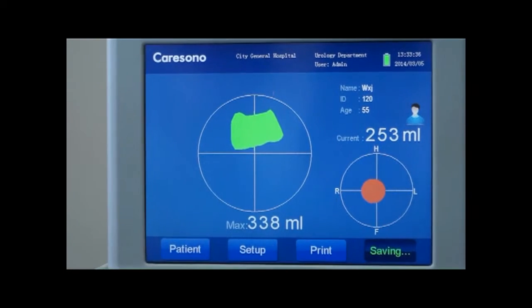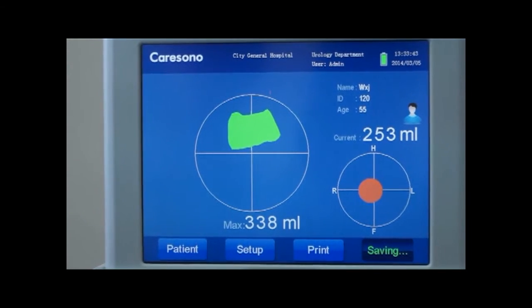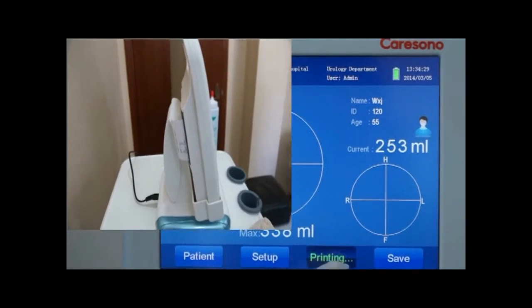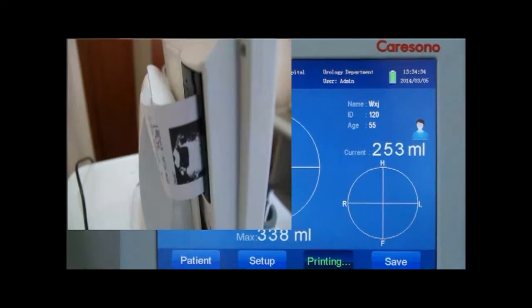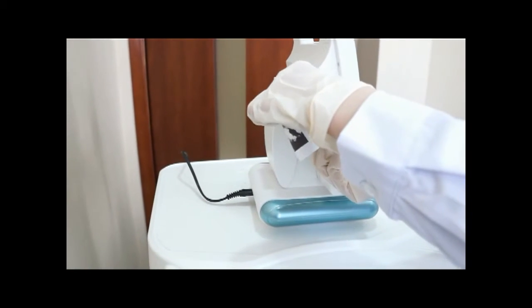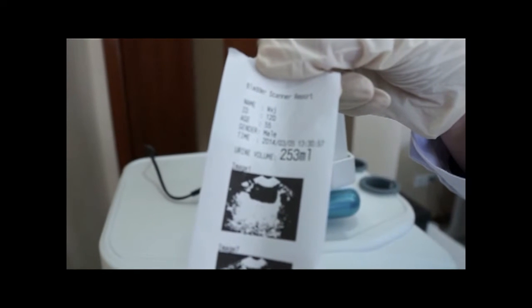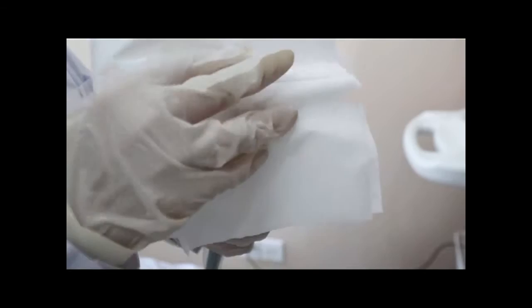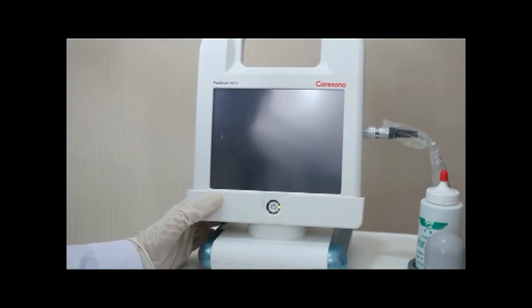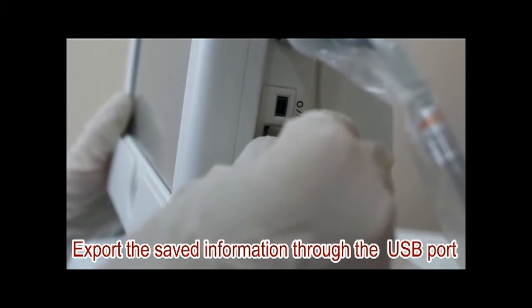Select save or print. Clean the probe and main unit. Export the saved information through the USB port.